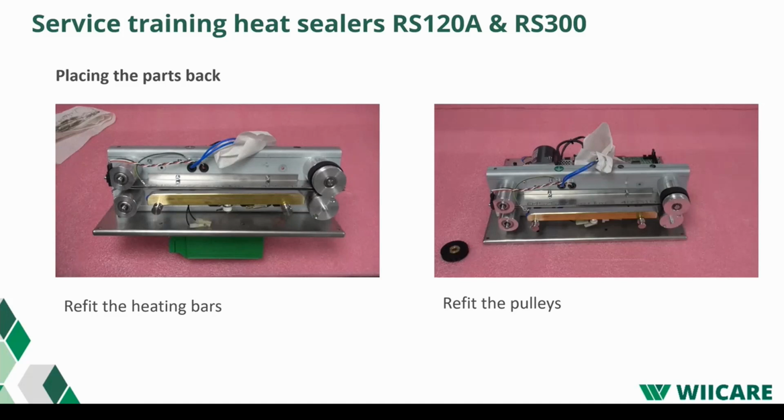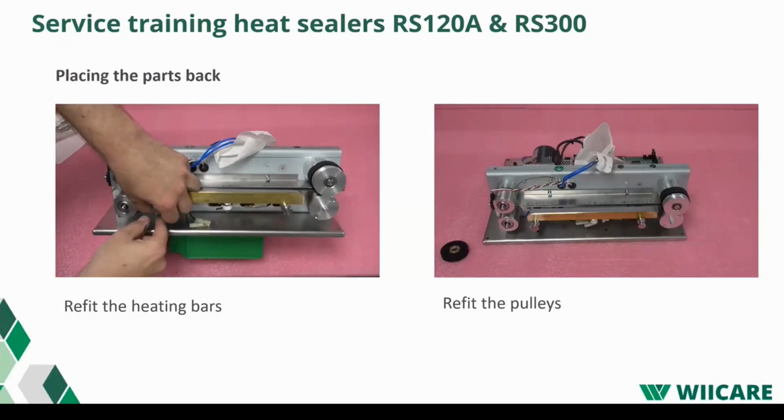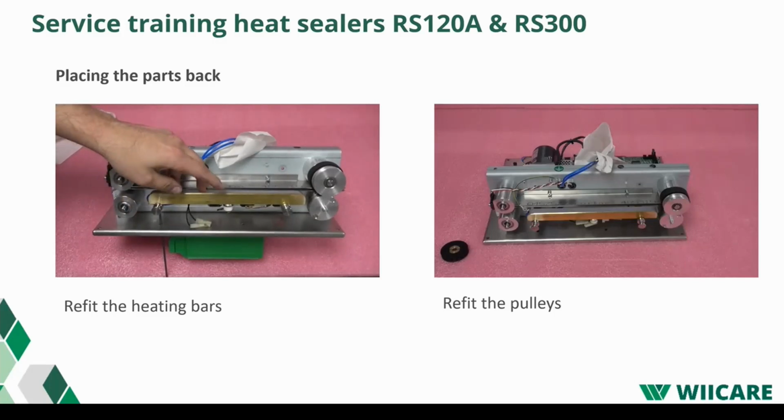Screw the heating element back on the support. Don't forget the insulation ring. Underneath the heating bar, there are two Teflon rings. They prevent too much heat from going to the machine. And also make sure that the heat element is at the correct level.